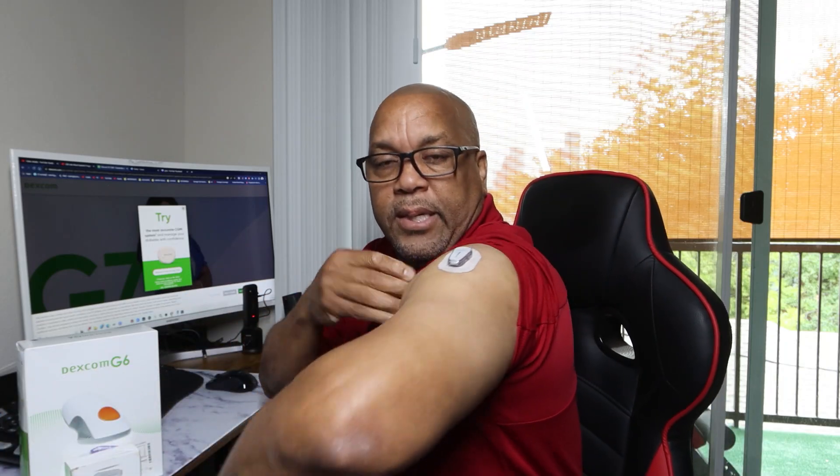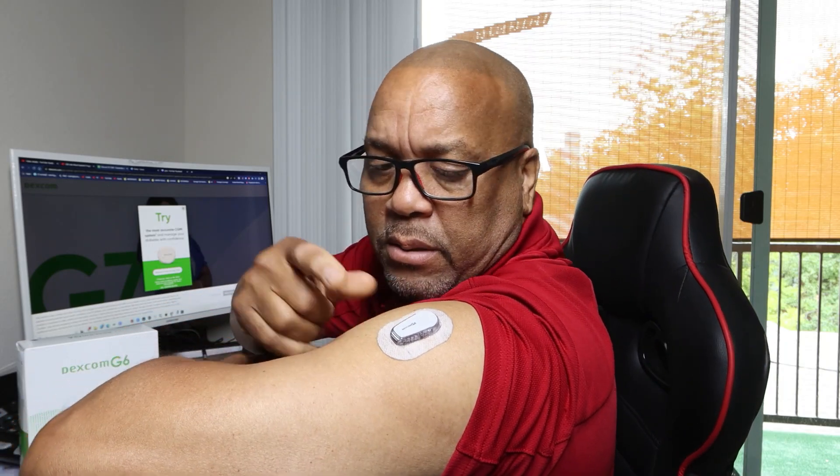There are built-in alarms, graphs, and everything you need. Whenever you eat something sweet or eat a banana, it tells you how much your glucose goes up, so you know what foods will spike your sugar. This is the new G7. The old one, the G6, is still around — I still have a bunch lying around that I have to finish using before I regularly start using this one.